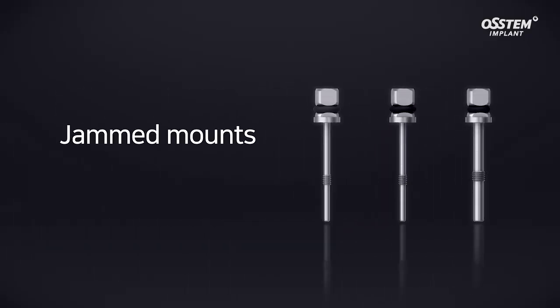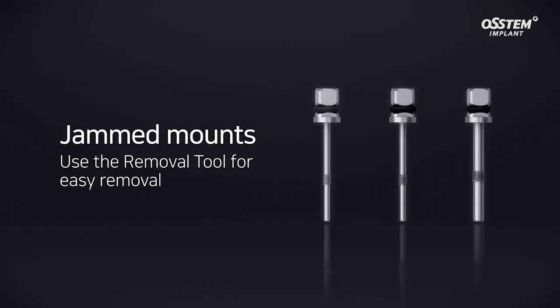If the mount gets stuck after placing an implant, the removal tool can be used to remove it.